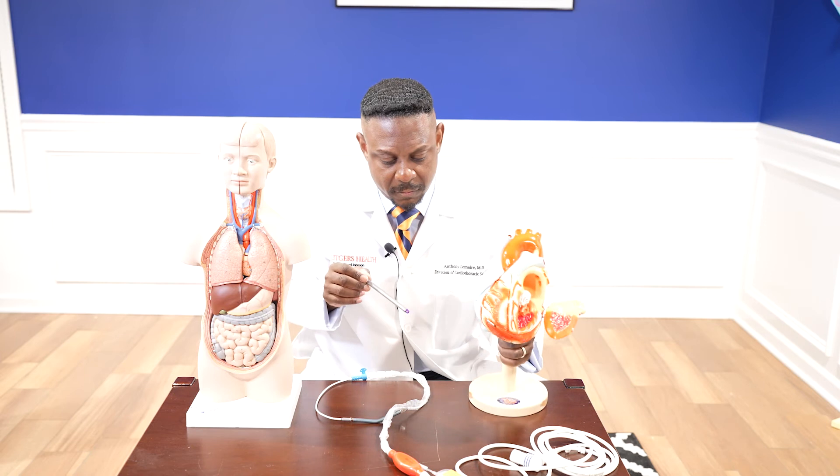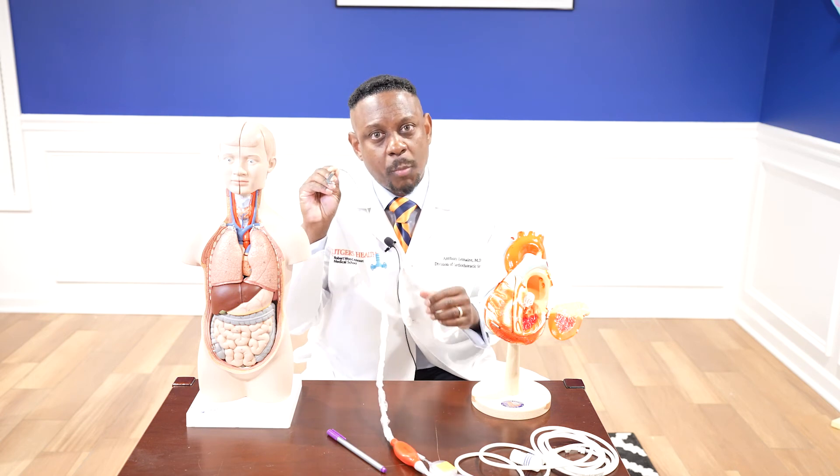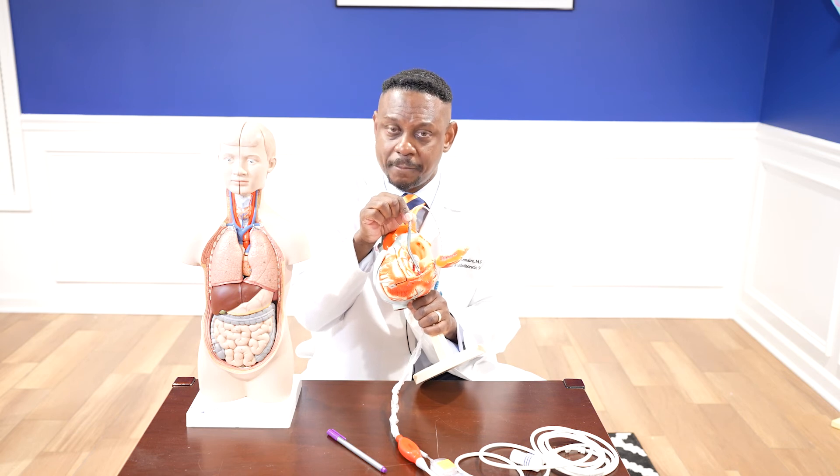Once the graft is in place, we'll take a wire and go through the graft, through the axillary artery, into the aorta, and into the left ventricular apex. To help guide us with wire placement, we'll use fluoroscopy — which is essentially just x-ray — and we'll also use transesophageal echocardiogram, which is essentially an ultrasound. With a combination of those two imaging modalities, we'll get our wire into the left ventricular apex. With the wire in place, we'll then take our impella device, place it on top of the wire, and direct it into the left ventricular apex. Once we're happy with the position of the impella, we'll pull the wire out, turn the device on, secure the impella, and then close our incision in layers.